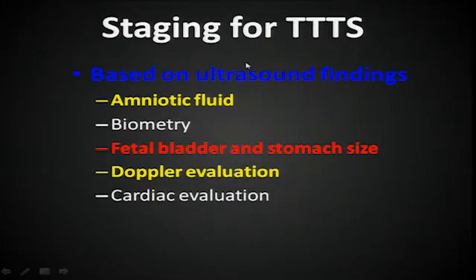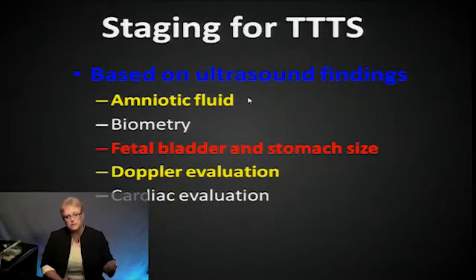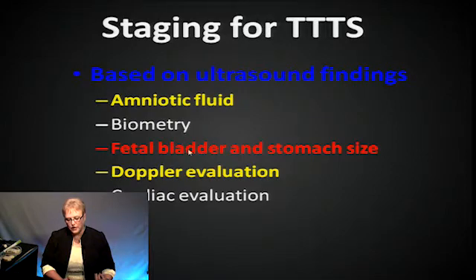So, staging for twin-to-twin based on our ultrasound findings. It's very important that you're very meticulous about what you're looking at and how you're documenting. We want to look at the fluid, the biometry, the fetal bladder and stomach size, looking at the Doppler evaluation, and then cardiac evaluation.